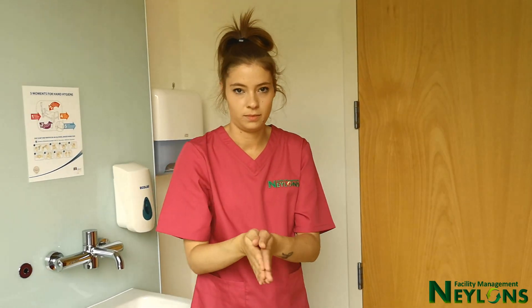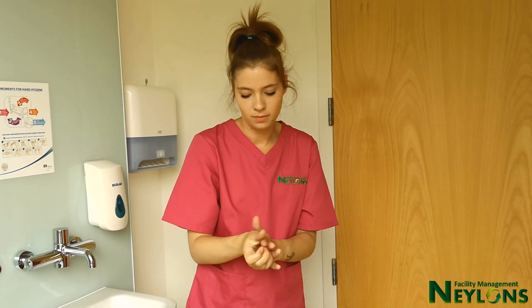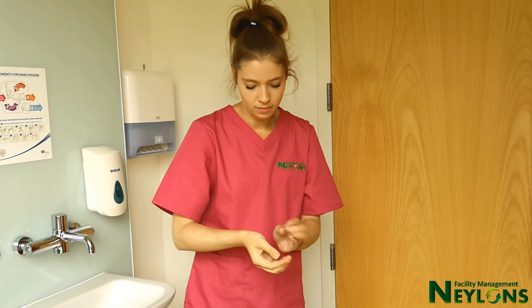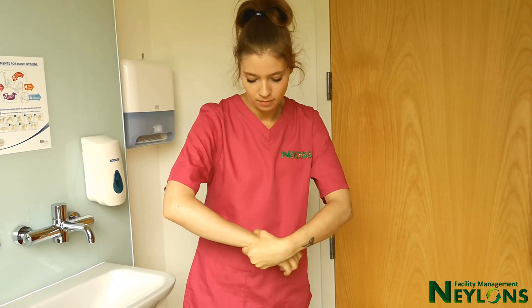When using an aerosol precaution mask, remove from the back away from your face. All contaminated PPE to be placed in a healthcare risk waste bin. If at any time you miss or forget a step, please decontaminate your hands.